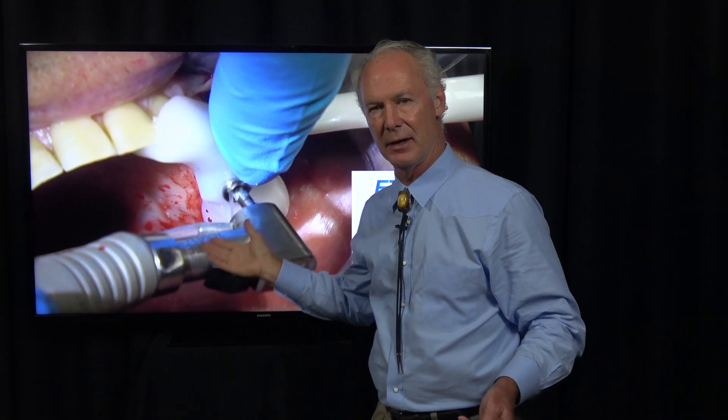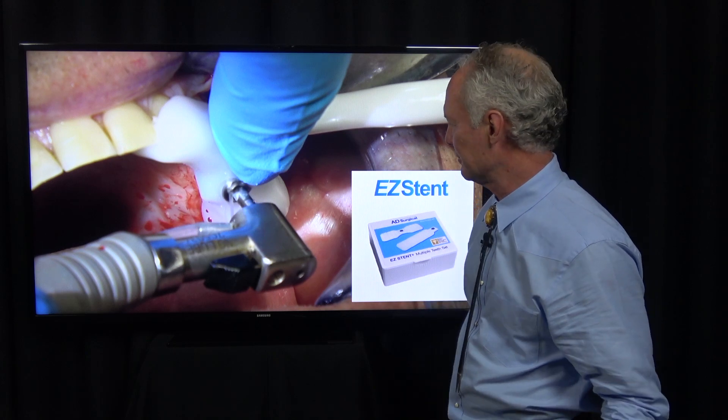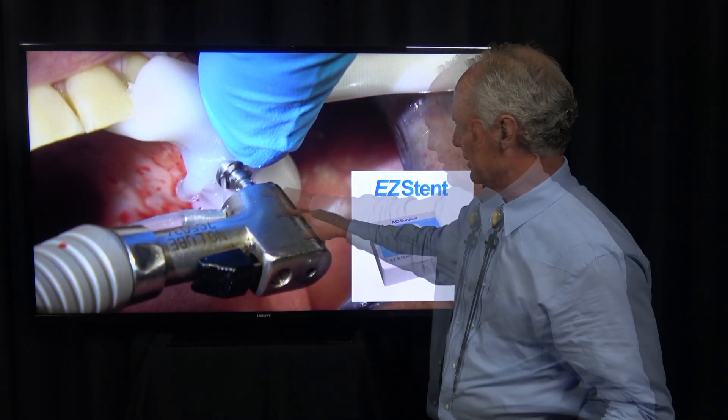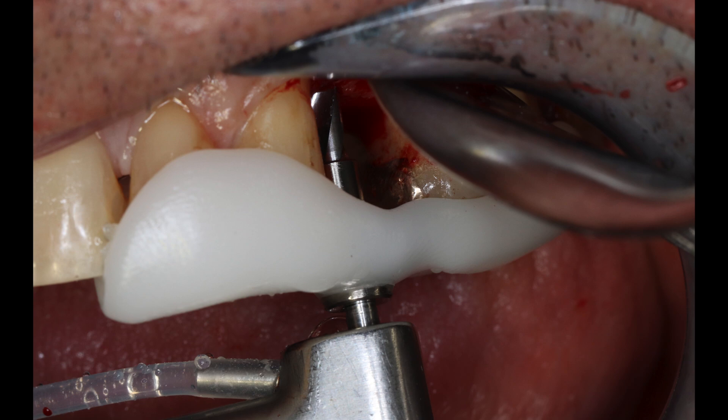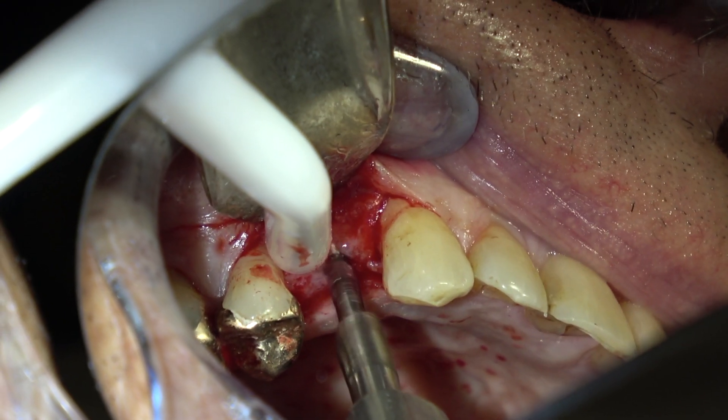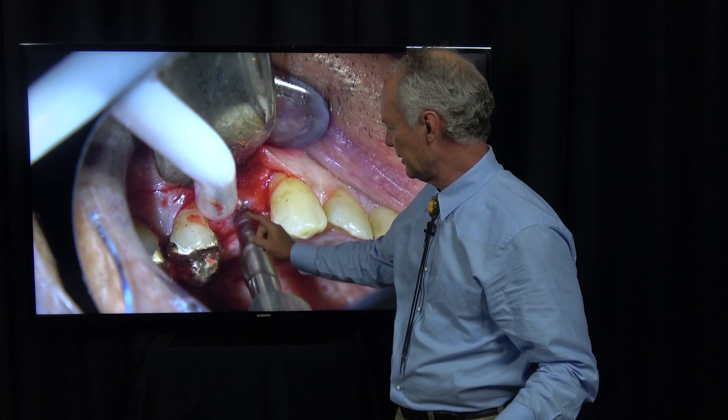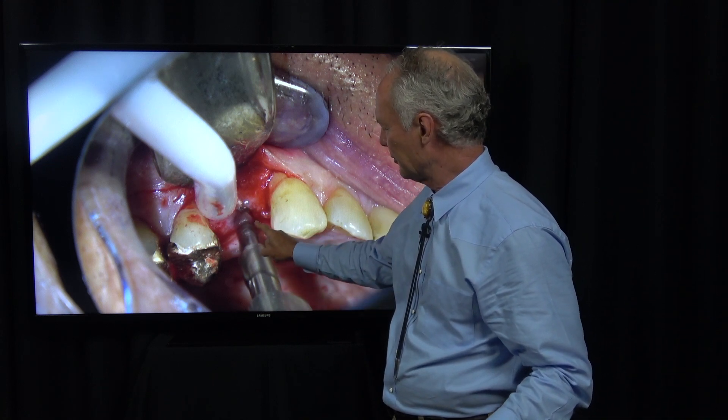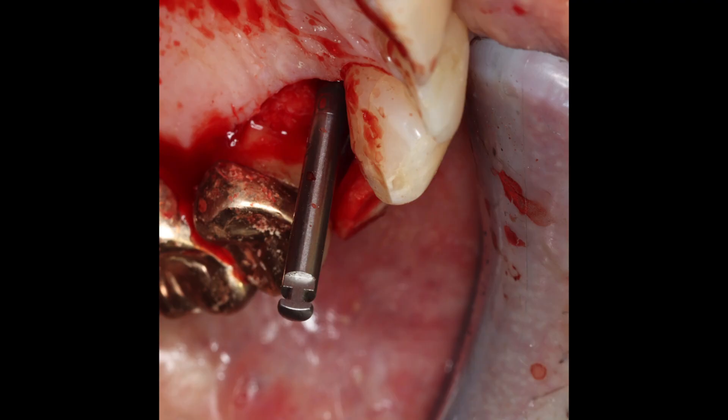If you're a little bit into the sinus, that's okay. Refer to the article on DentistryMasterClasses.com about sinus penetration. This drill comes with the Easy Stent and perfectly fits into that hole, so you know you're in the right spot. I drill through the hole into the bone, then take the stent off and drill to the proper depth, about 15 millimeters.